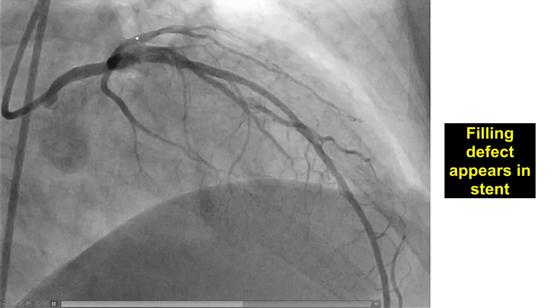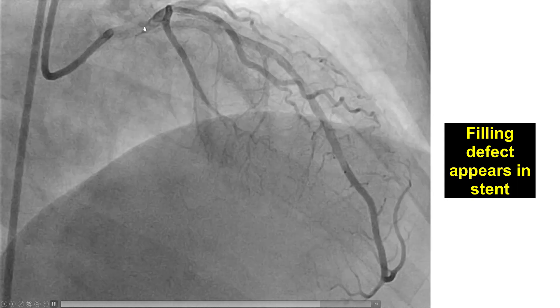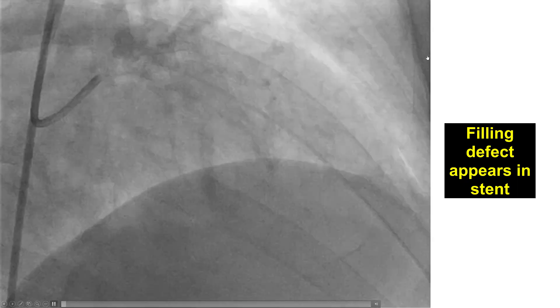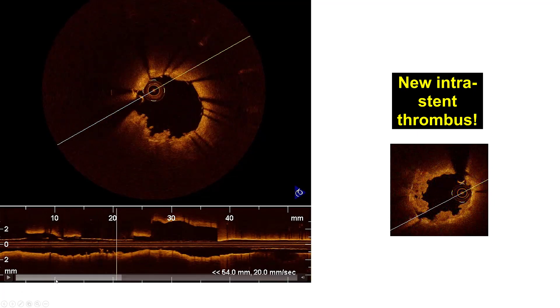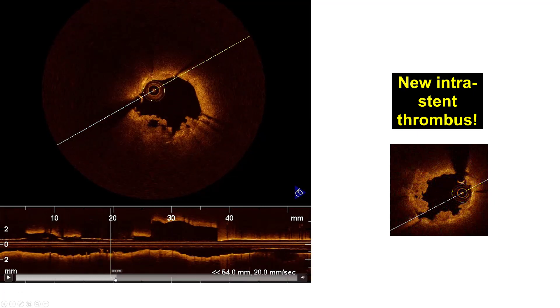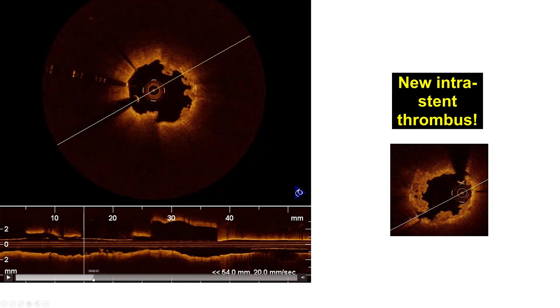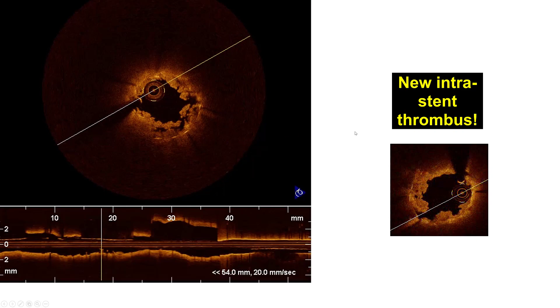Everything was going okay. However, within a few minutes and just before finishing the procedure, we noticed another lesion developing inside the stent, which was hard to explain given the good early result. We repeated OCT and this was fairly enlightening — it demonstrated acute stent thrombosis in the making. The recently implanted stent showed an enlarging amount of thrombus protruding into the lumen, starting to form inside the recently placed stent.